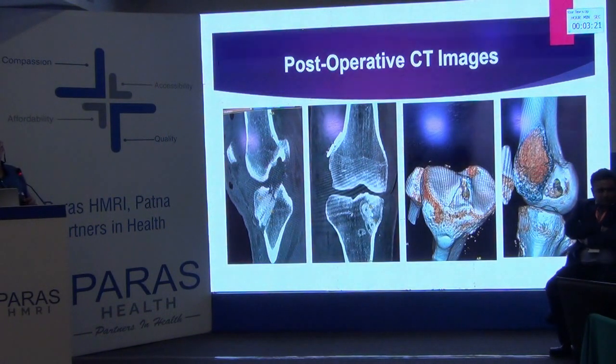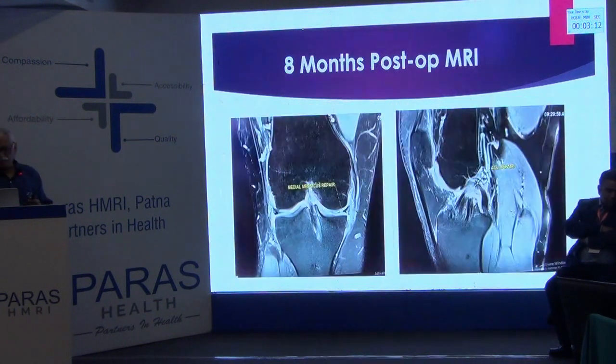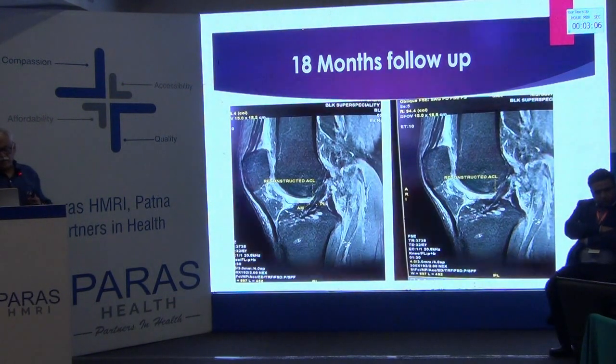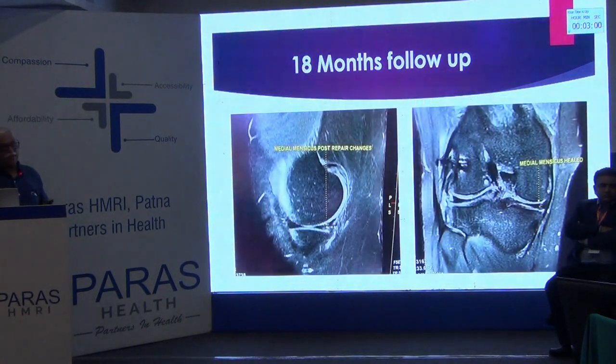We sometimes validate our tunnels just to see that they are on the correct anatomical position, like in this case, and all the tunnels are anatomical. And this is follow-up MRI of the same patient, and at 18 months you can see that both the bundles, the AM and the PL, you can very well appreciate, and the meniscus bucket handle has also healed quite well.